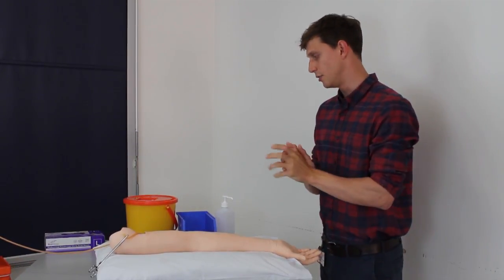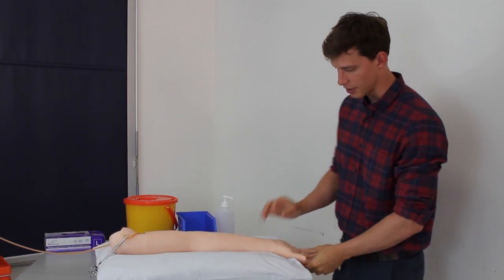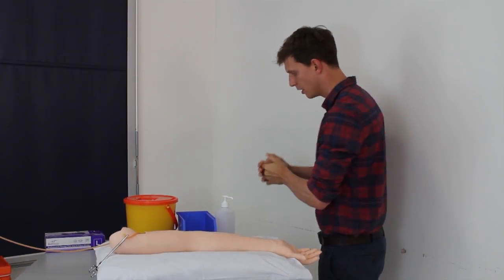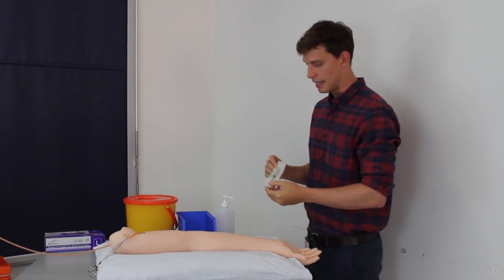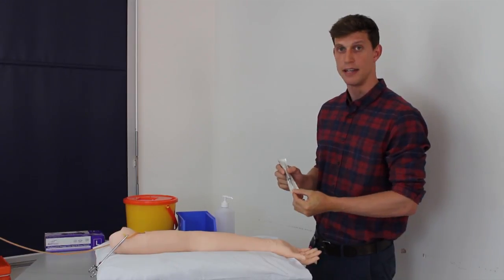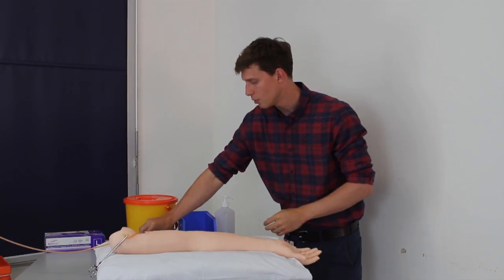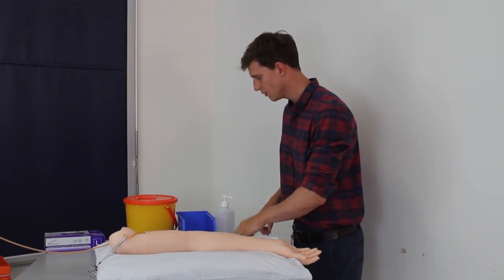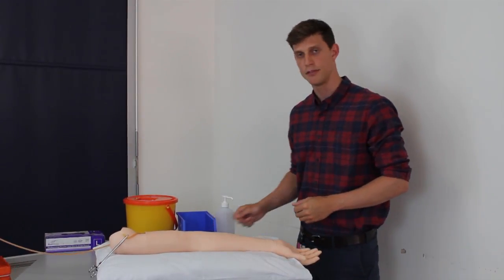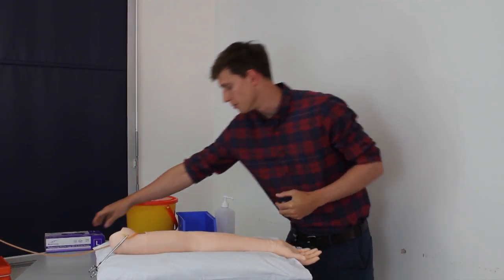First of all I need to make sure that the patient is correctly exposed and positioned, with comfortable access to the wrist, and gather my equipment. I need the arterial blood gas syringe which comes preloaded with heparin to prevent the blood clotting before taking it to the analyzer, some swabs, an alcohol wipe, tape to fasten down the swab, a sharps bin, and gloves.